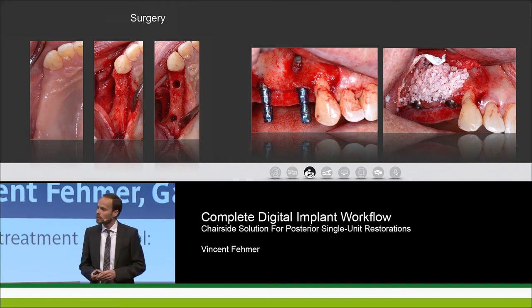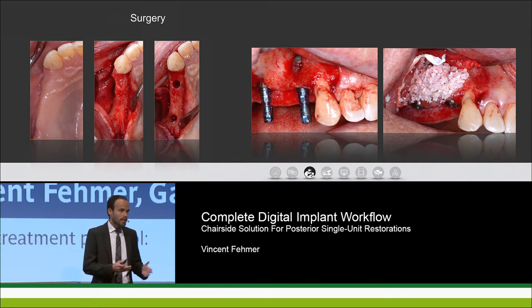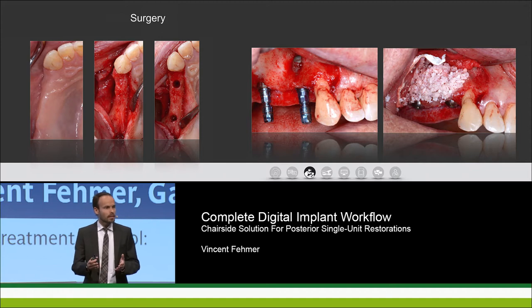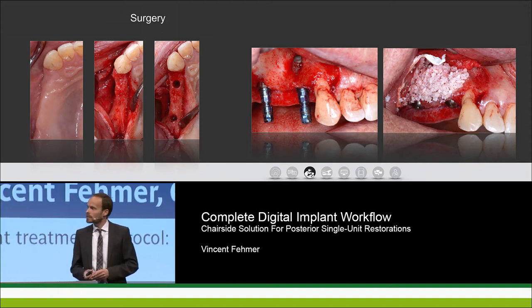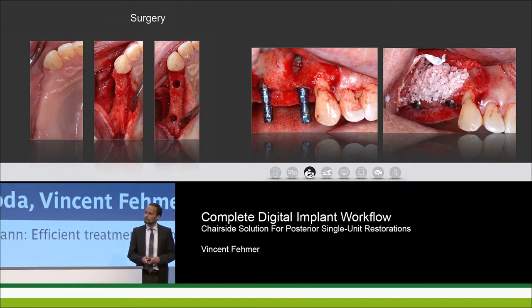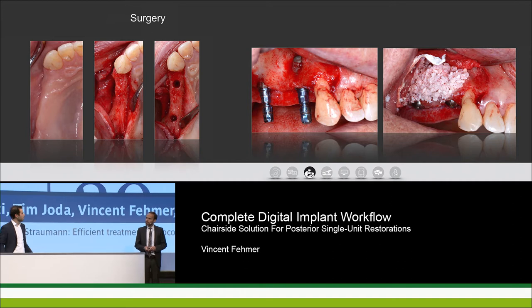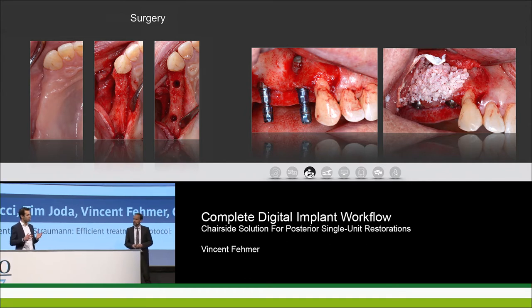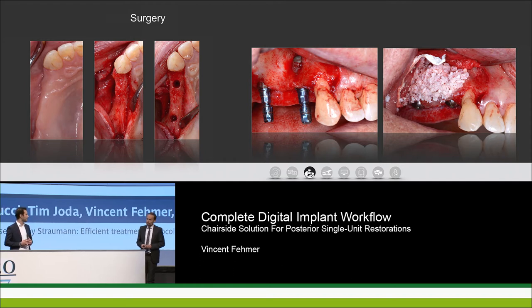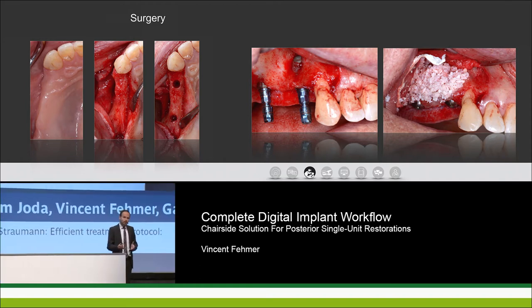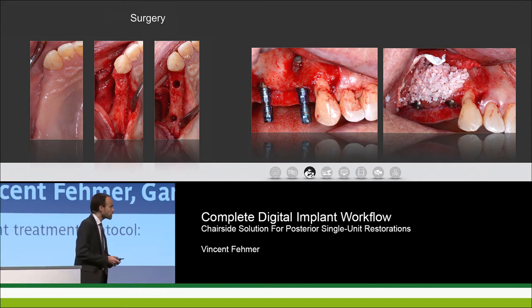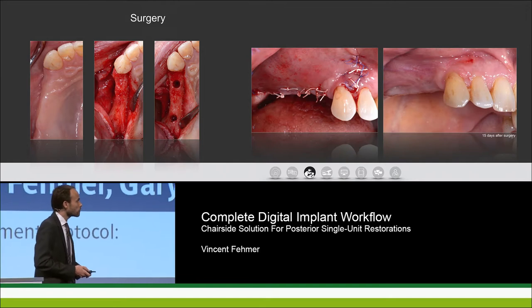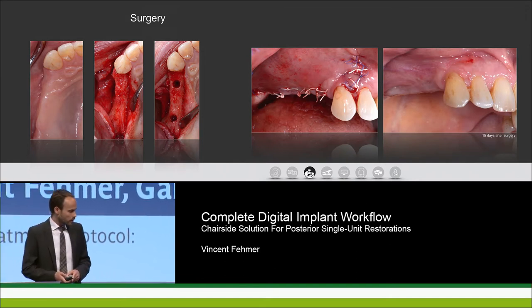The question was whether to place two tissue level implants with a mesial cantilever. Gary commented that for this indication, tissue level is a perfect choice given favorable soft tissue and bone conditions. In some situations closer to the anterior zone, a bone level implant can give more flexibility. We considered combining both types but kept it simple with two tissue level implants. You can see the GBR performed and wound closure after 15 days — everything went event-free.